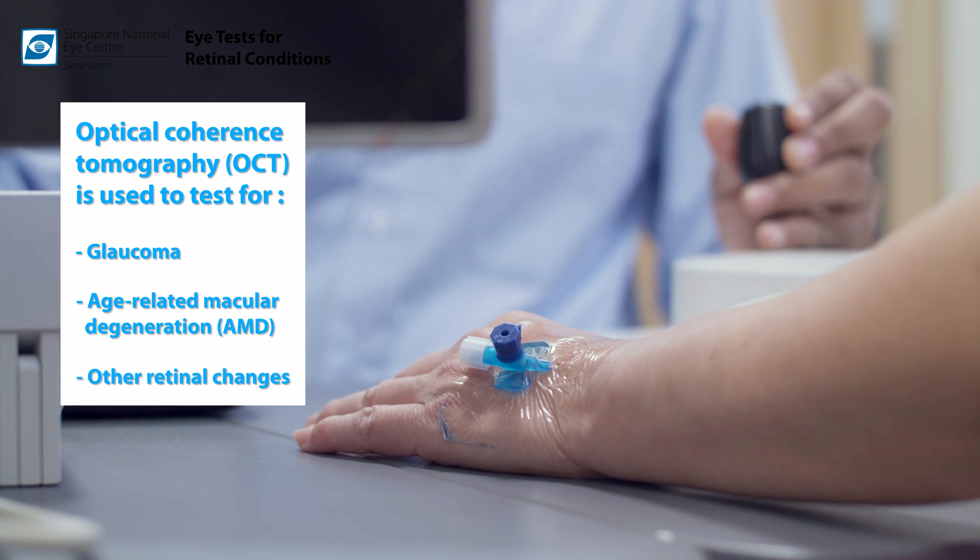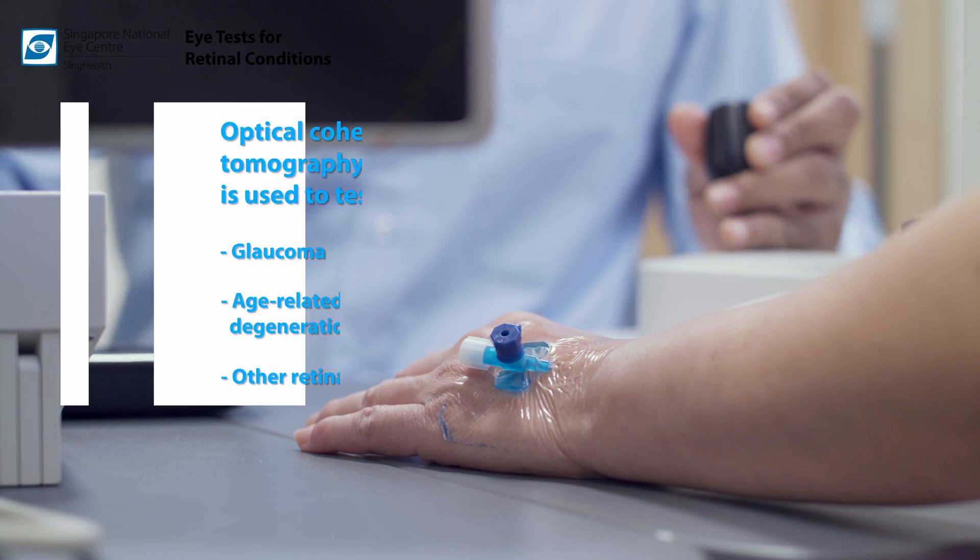OCT can also be used to test for glaucoma, age-related macular degeneration or AMD, and other retina changes. The test takes around 1 to 2 minutes to complete.